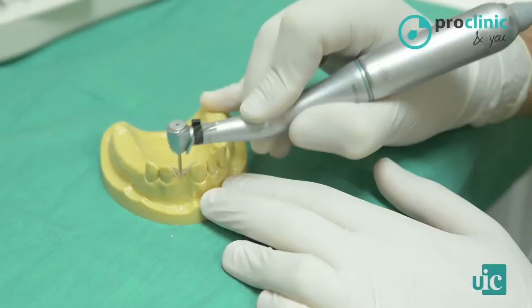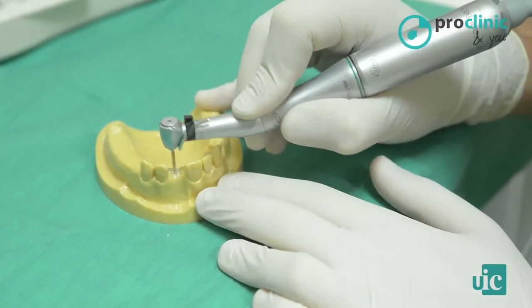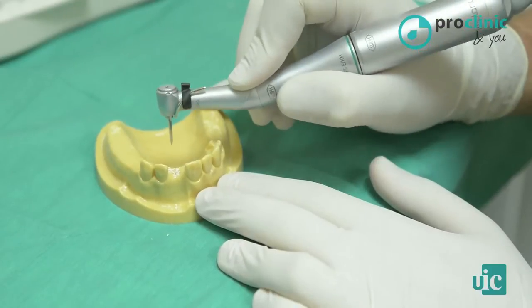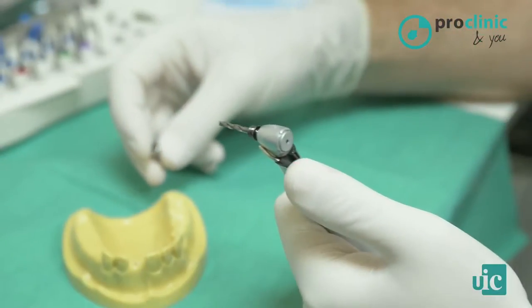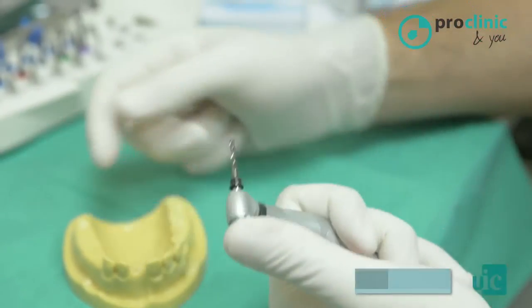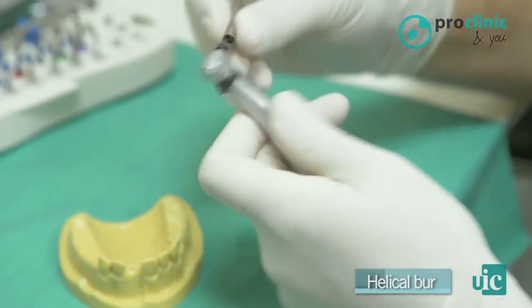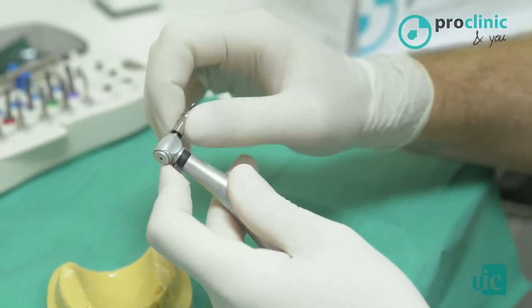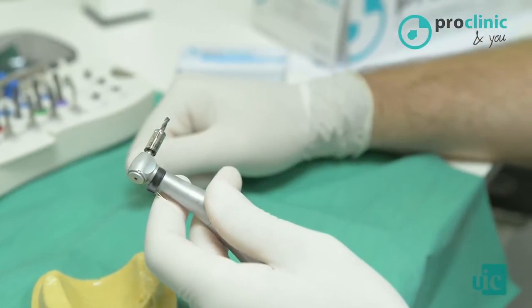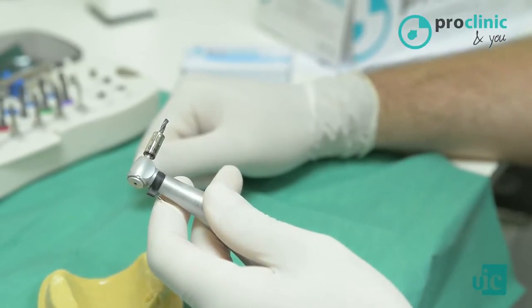We must drill down to a depth of 1 to 1.5 millimeters in the crestal cortical bone. Once we have reached this depth, we can use the helical burr sequence in order to widen the implant bed diameter. We can use depth stop devices to have the working depth controlled at every moment, and to avoid any complications while we are drilling.